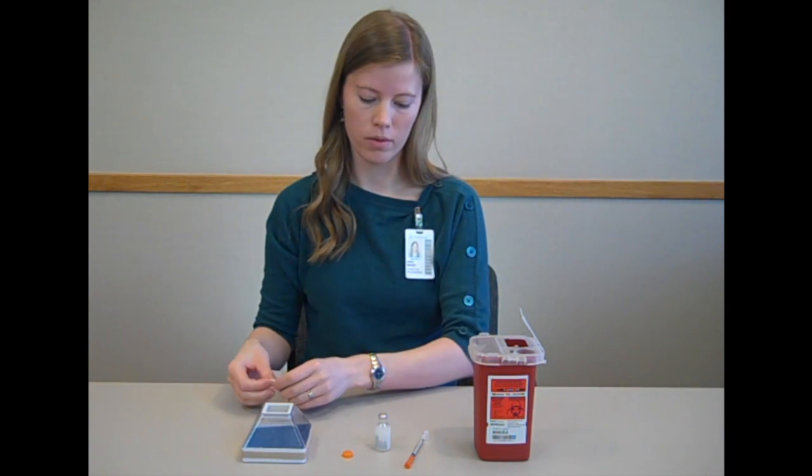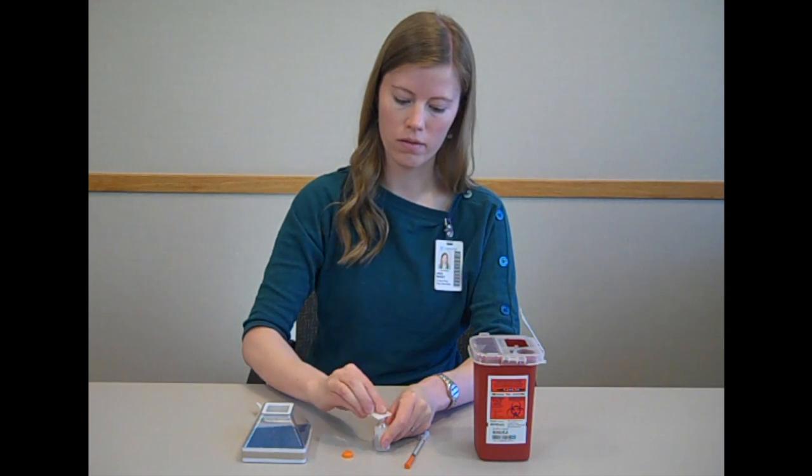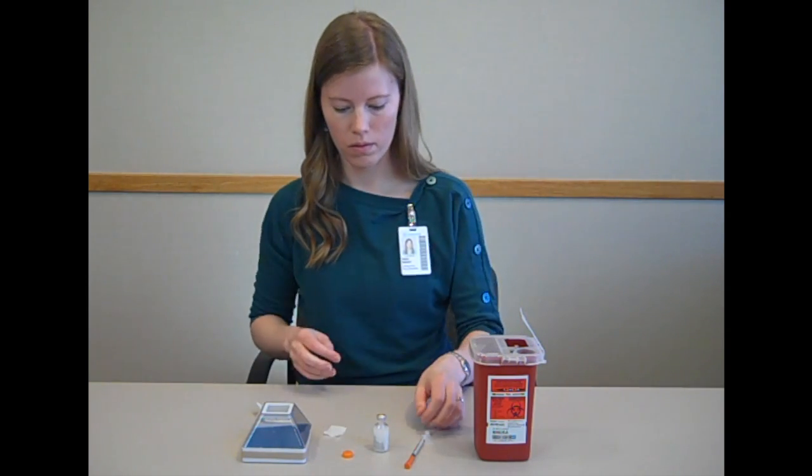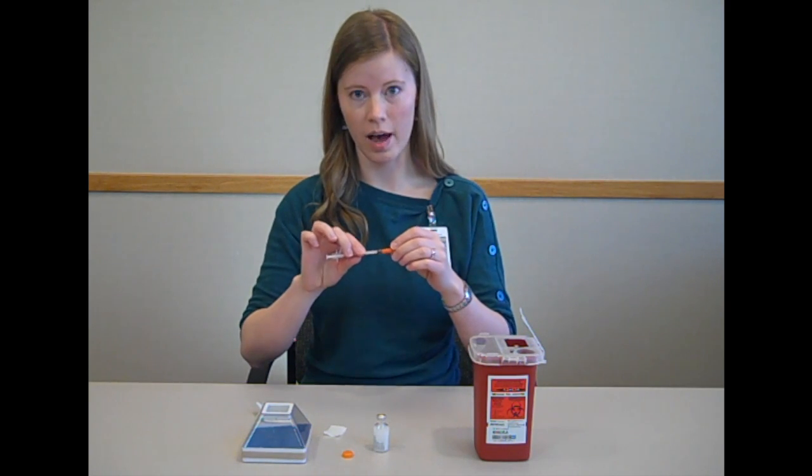Then use an alcohol swab to sterilize the top of the vial. At this point, take your syringe and remove the cap from the needle.